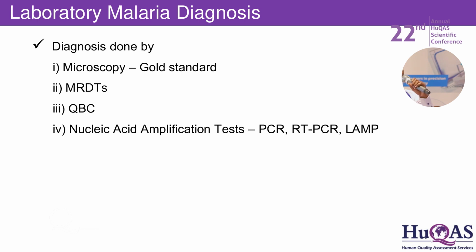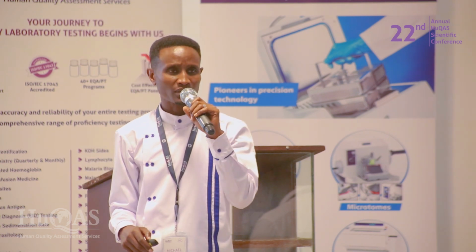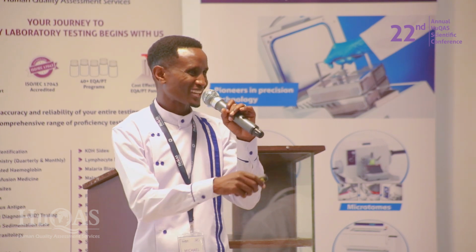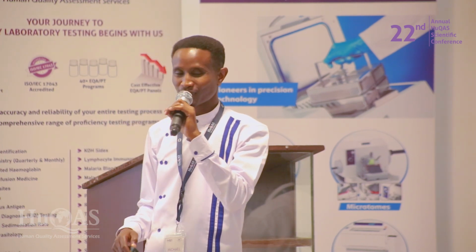Malaria diagnosis can be done through various methods. One of them is microscopy, which I will talk about here mostly, but we have others through rapid test kits, QBC, and nucleic acid amplification methods, like PCR, real-time PCR, LAMP. I think Mr. Chege has not talked about their LAMP equipment, yes. TB LAMP. It can be able to do that for us as well.